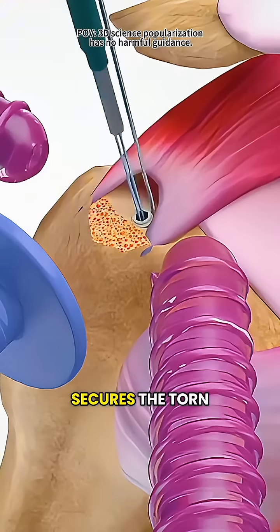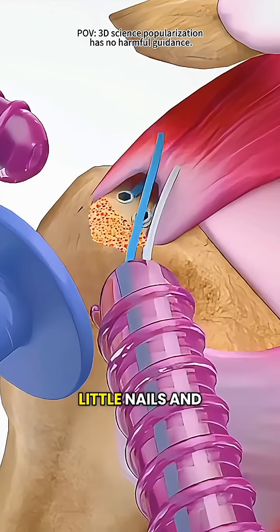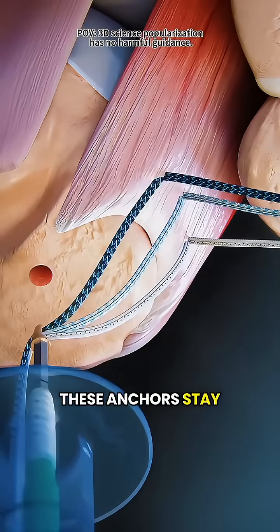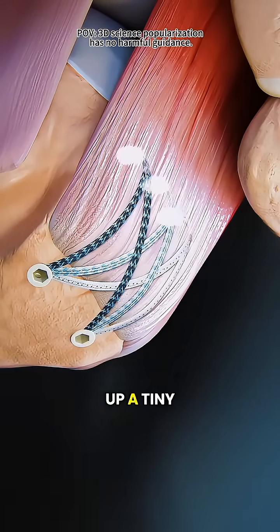Next, the surgeon secures the torn tendon back to the bone using small anchors that act like little nails and strong stitches. These anchors stay in your bone, giving the tendon time to heal — almost like putting up a tiny scaffold.